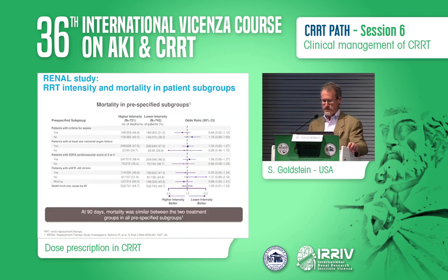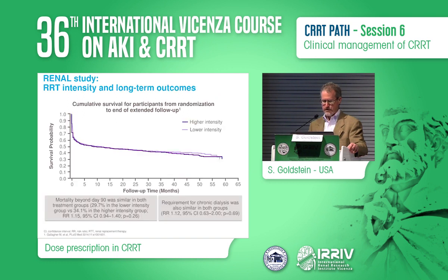The renal study also looked at a number of secondary endpoints, as I've mentioned, and again, mortality at 90 days, and all the pre-specified subgroup assessments demonstrated no difference between those who received intensive CRT versus less intensive CRT. If we look at long-term outcomes as well, there was no difference between the groups.